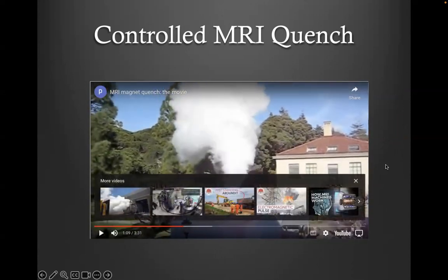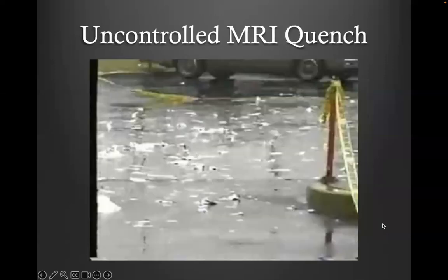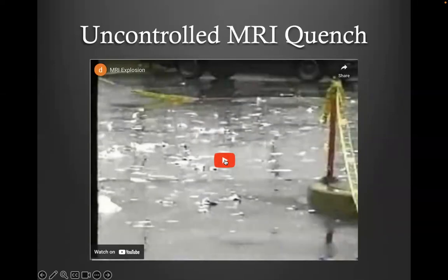That's when you decommission your MRI, and if you want to have fun, then you do a quench and see what the quench button does, but you don't want to do that. And this is an uncontrolled one.